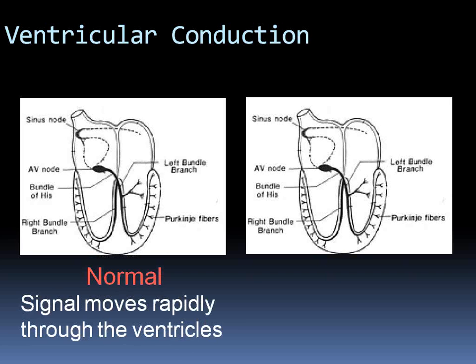Dr. Sewani, I have a question. Yes. In cardiac rehab, we commonly see PVCs in patients, but in most patients they will come during peak exercise. You find that during warm-up you don't see them, at peak exercise you see them, then at cool-down they disappear again. Is there something that we should worry about?